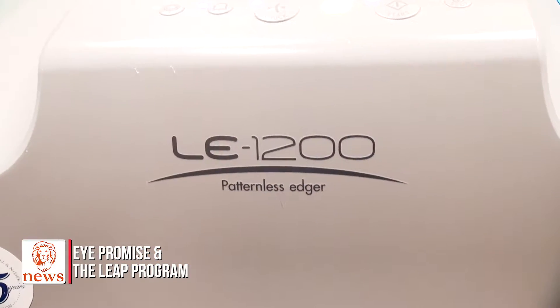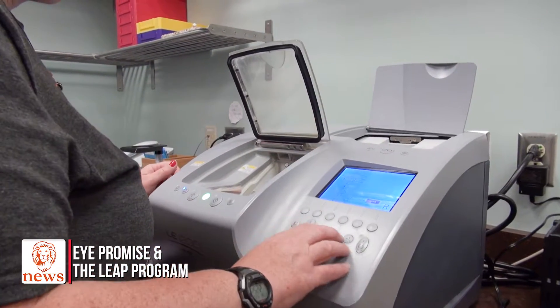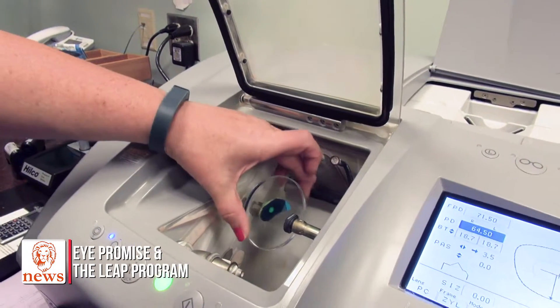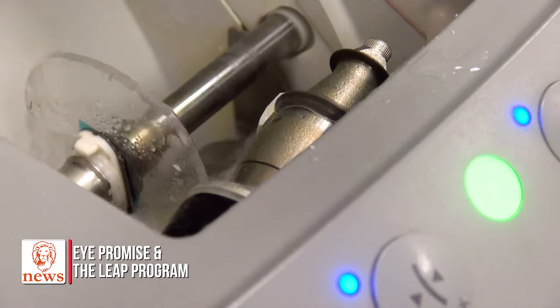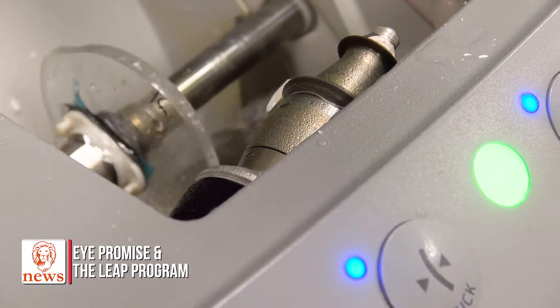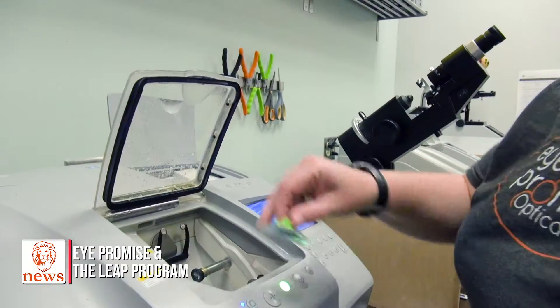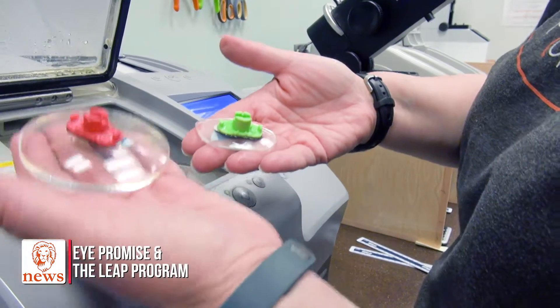We gave our job a number, and I'm going to go ahead and call that number up. Everything here is automated. Placing the lens into the machine, I push the start button and off we go. You can see we have a nice shape compared to what we had initially.